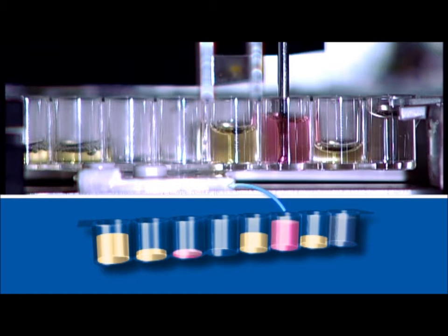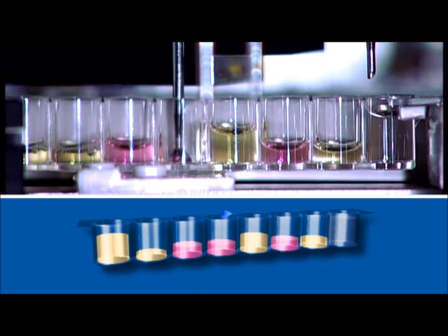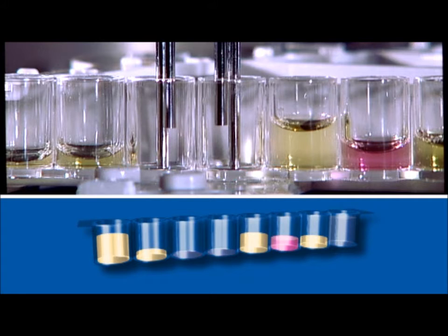In the fifth step, Allegria pipettes conjugate into the sample and control cavities. In the sixth step, Allegria incubates and then washes the control cavities.